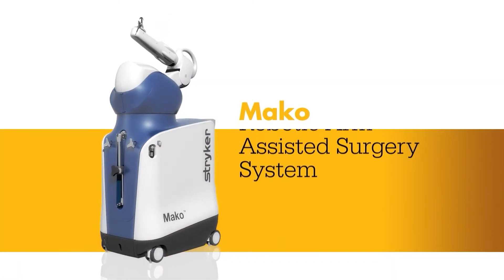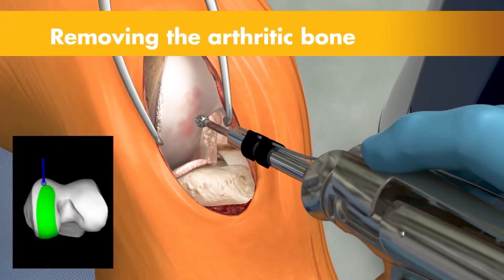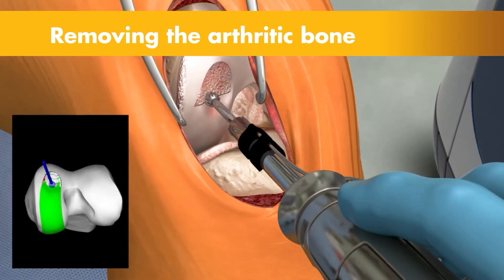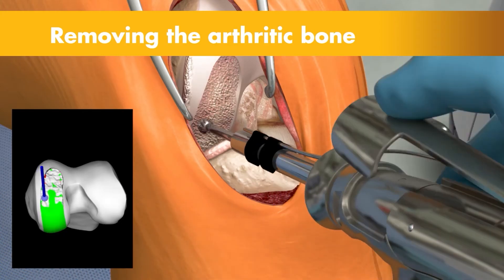instead of using saws and guides, we can use a robotic arm that's far more precise than anything we ever could have done in the past. It fits the plan that we did on the computer screen and permits the implants to match perfectly onto the patient's knee.